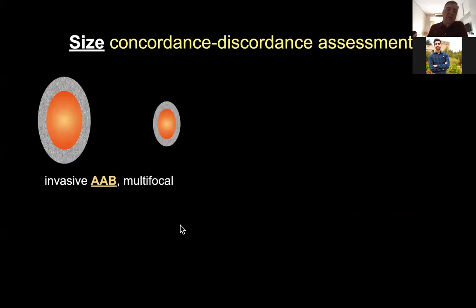Now, if we have multifocal disease, size will not equal extent. The size will be the maximum diameter of the index lesion, including its thick echogenic rim, but the extent is going to be the outside to outside distance between the two foci. Now, in terms of surgery, how far apart these are can make a difference, because in general, if this extent is more than 5 centimeters, they're going to say the patient needs a mastectomy.